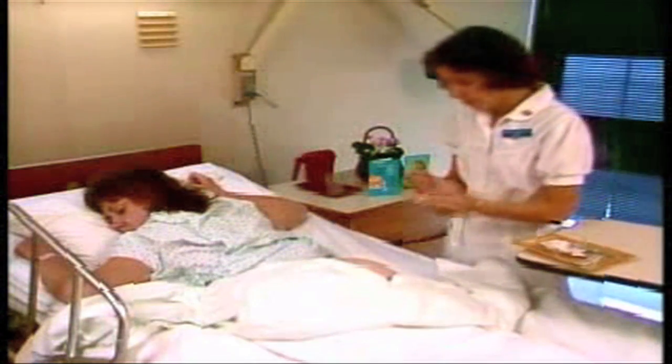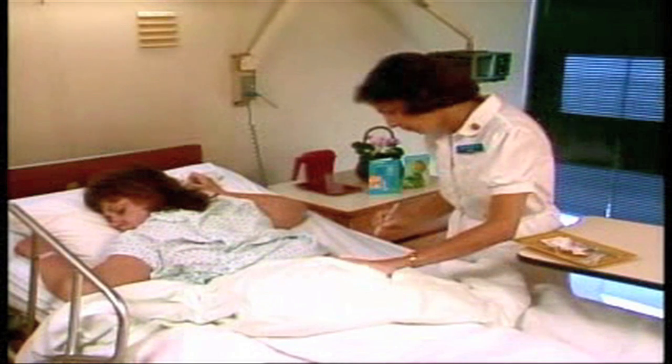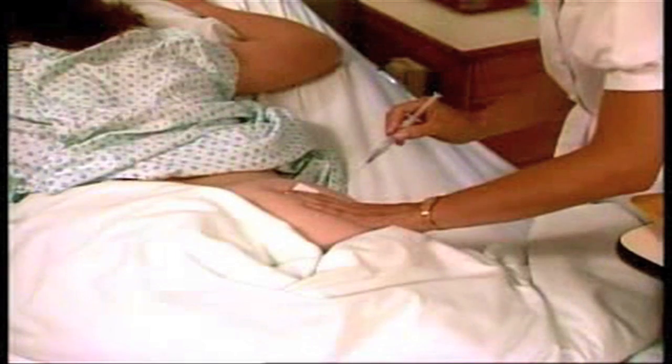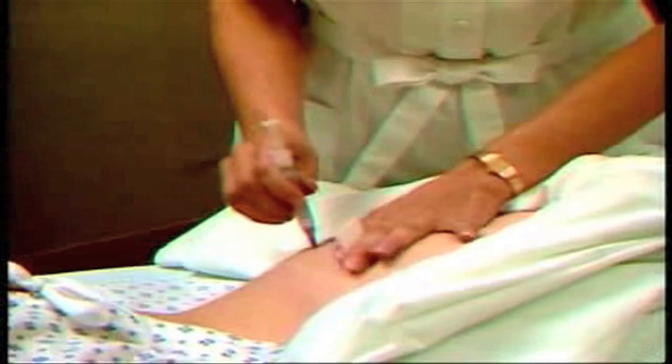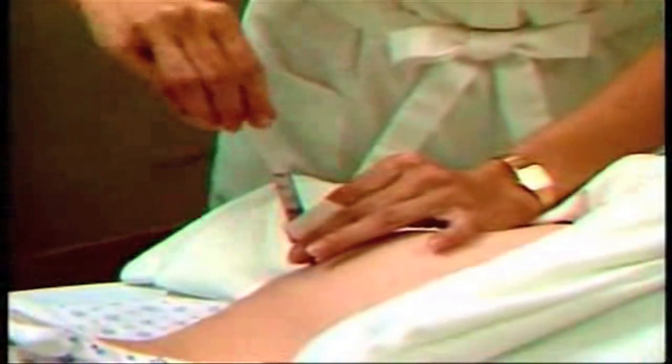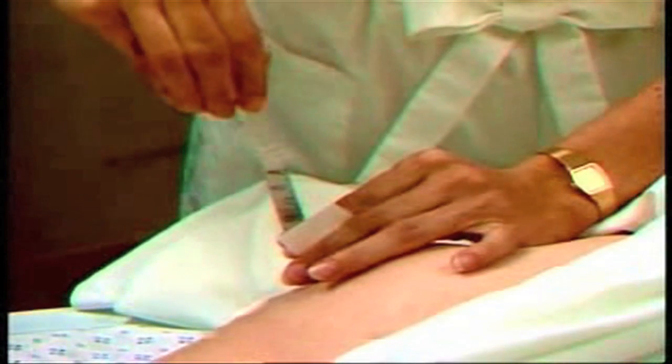Use the thumb and index finger of your non-dominant hand to gently stretch the skin taut over the injection site. Hold the syringe like a dart in your dominant hand. Insert the needle at a 90-degree angle using a smooth, even movement of your wrist. Pull back on the plunger to be sure the needle has not entered a blood vessel. If blood is aspirated, remove the needle.